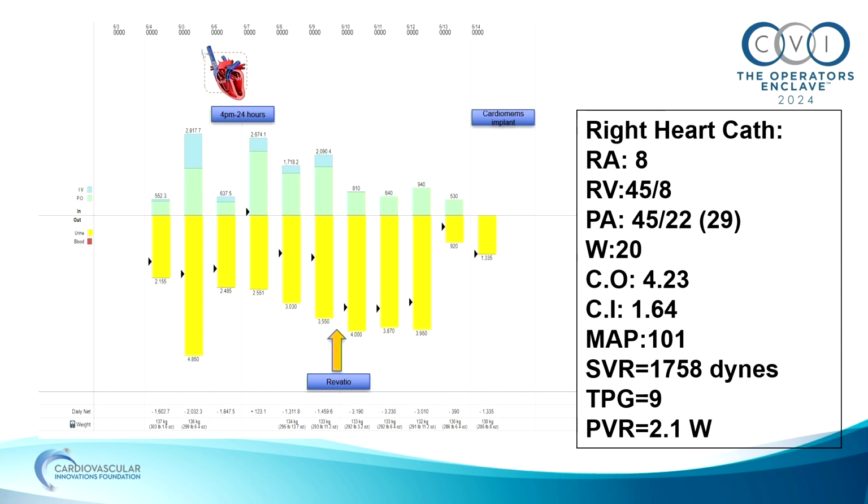I think this is an older version of my slides. Looks like they've uploaded. But these were hemodynamics at the end of the visit. Prior to this, the hemodynamics up here showed that the RA pressure was about the same. PA pressures were still in the 60s. They got a little better, but not completely normalized. And of course, we did some Revatio, increased diuretic here to 10 milligram per hour for a day. And then the patient went home with these hemodynamics.